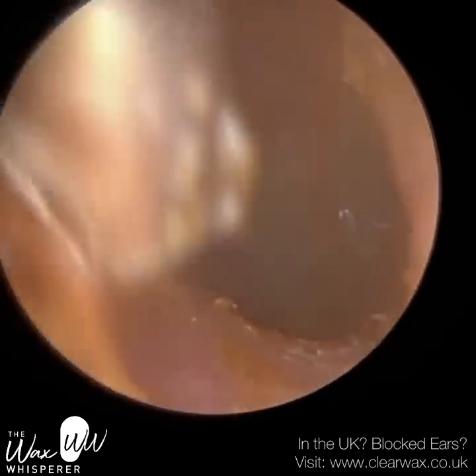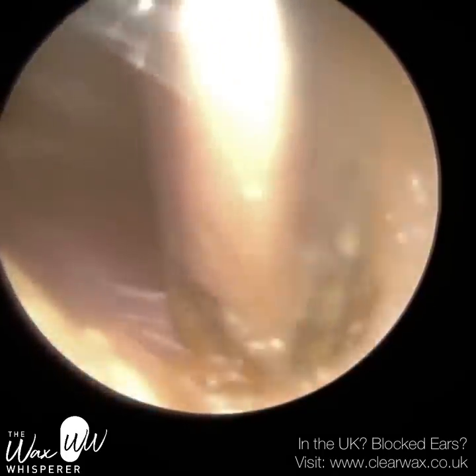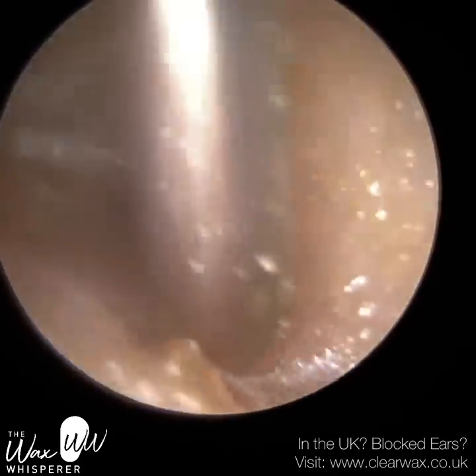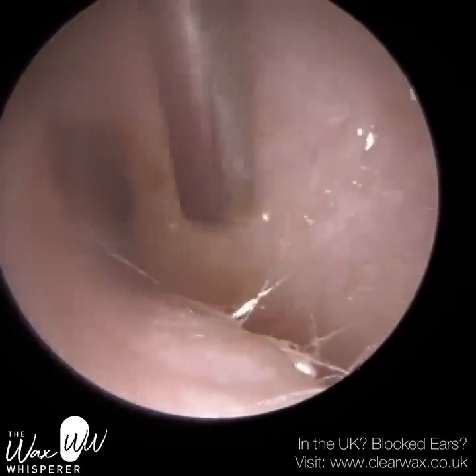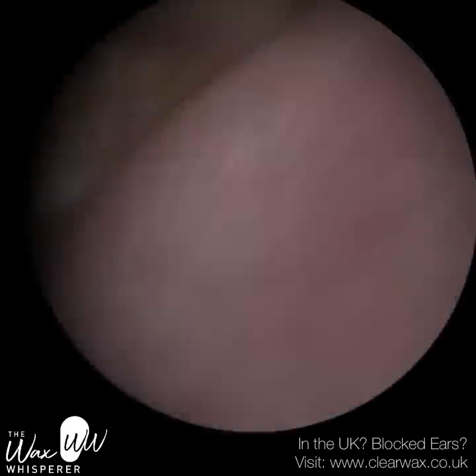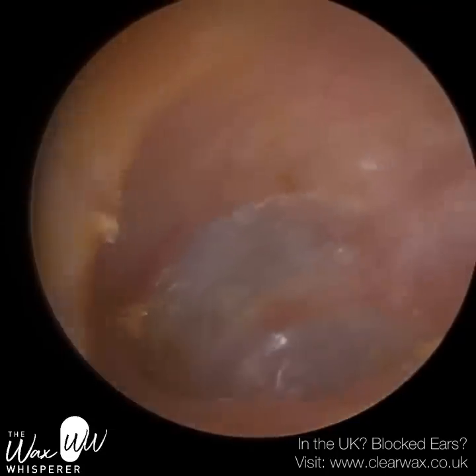You can see the suction probe making contact with the canal wall on the right-hand side — that's the cartilage, you can see it moving. The cartilage is semi-flexible. But beyond that boundary, it's all bone, and the bone is of course rigid. Watching this back, you can also see how bendy this patient's ear canal is. It veers off to the left, through the narrowing, and back to the right.